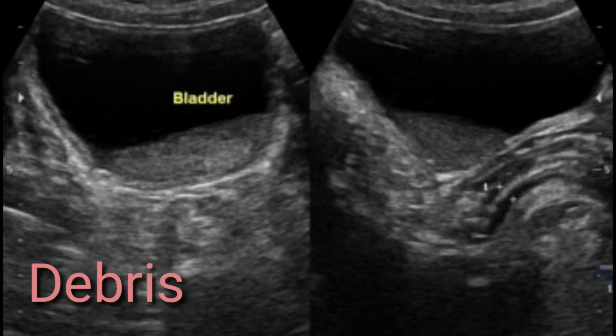But if you shake the patient or ask the patient to roll around, this will again move from one side to another, and the low level echoes will start floating within the lumen. So this is the example of the debris, and usually it is the thick part of the bladder content, which you can call clumps of RBCs, clumps of pus cells, or clumps of neutrophils or leukocytes. So usually these appear in the form of debris.